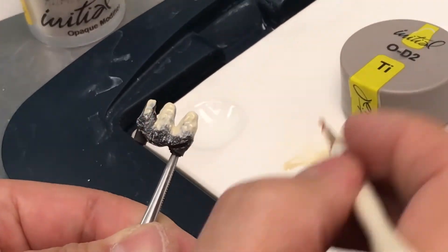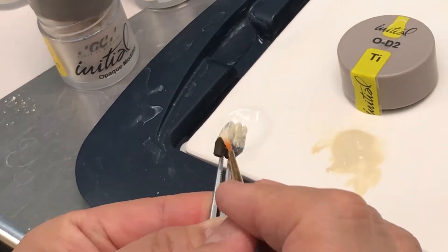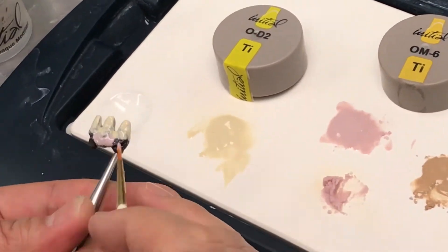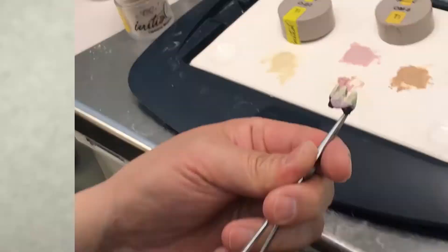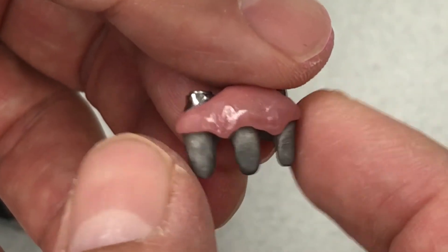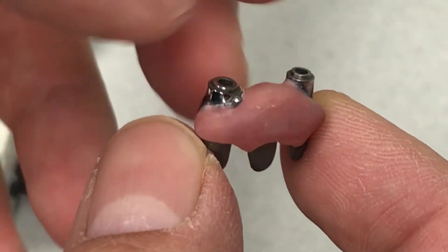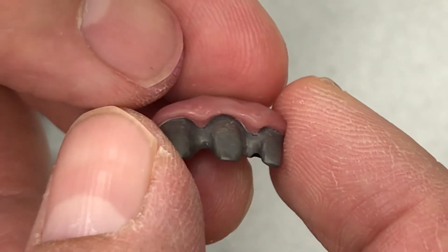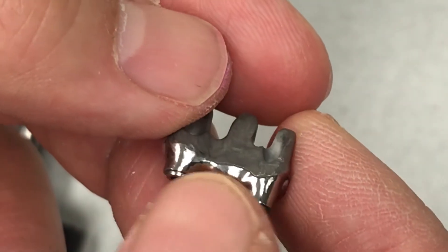Now we add porcelain. We created the titanium minibar and made the porcelain — baking porcelain fused to titanium — and then we polish it underneath.